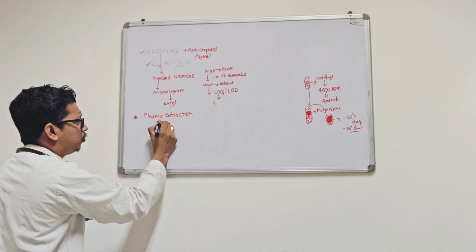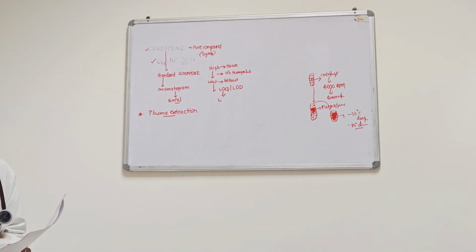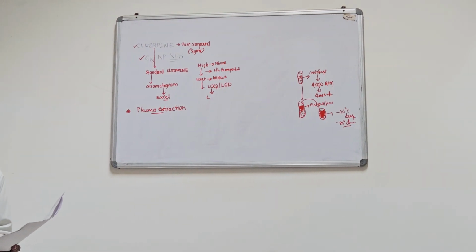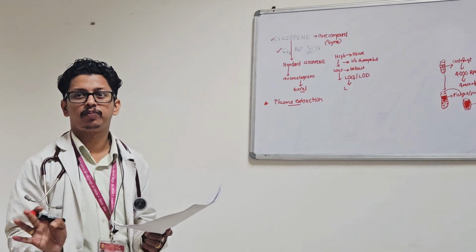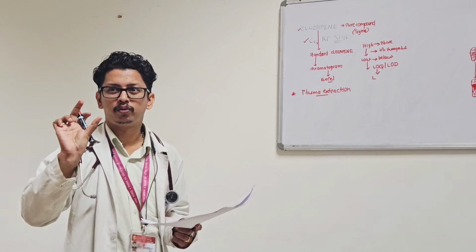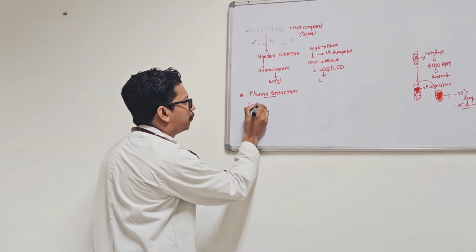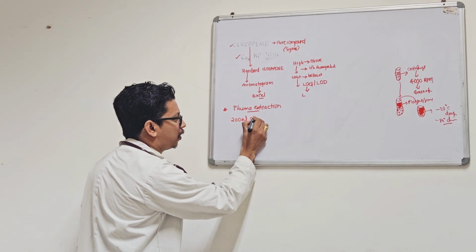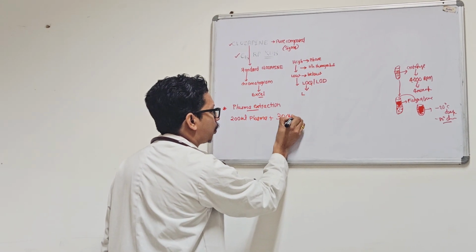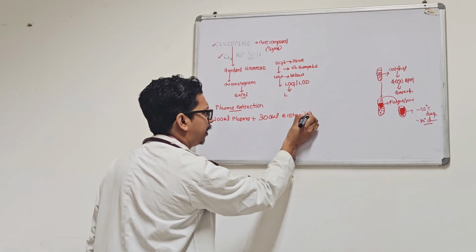Clear? So this plasma extraction is a process by which we get only the solvent or solution dissolved with the now desired compound to be detected. Clozapine है तो clozapine, या phenytoin है तो phenytoin, या metoprolol है तो metoprolol, उसमें dissolve होगा उस solvent के अंदर. उससे करने के लिए हमें 200 microliter of plasma लेके उसमें 300 microliter of acetonitrile compound add करना है.